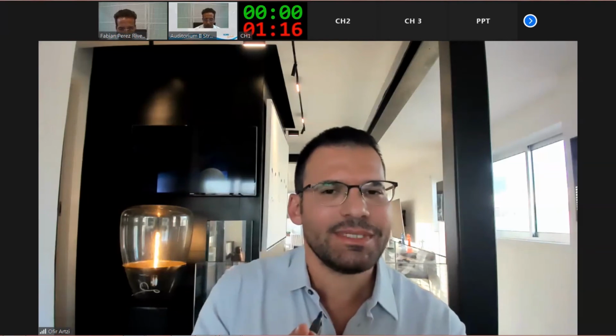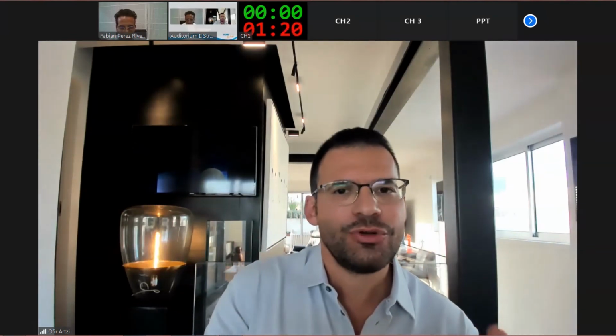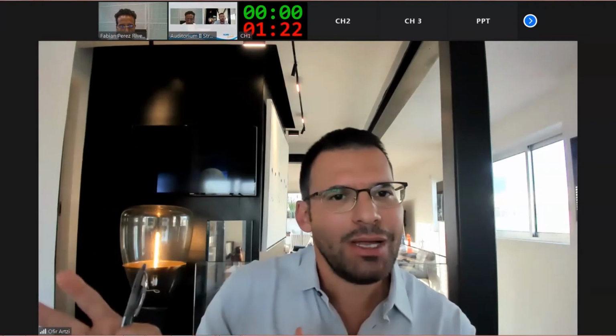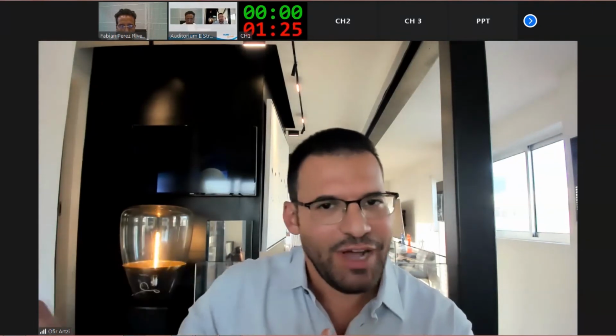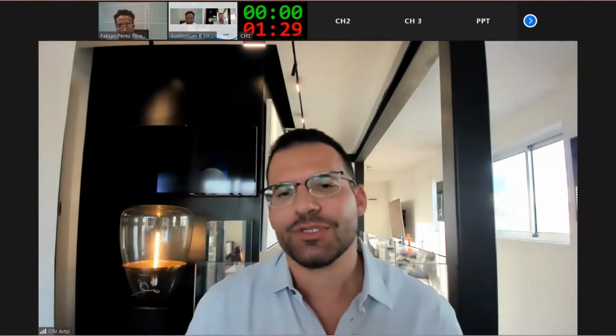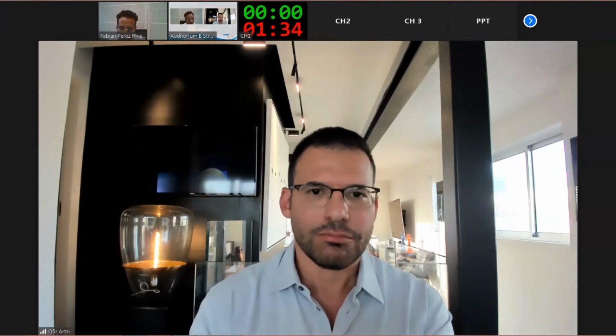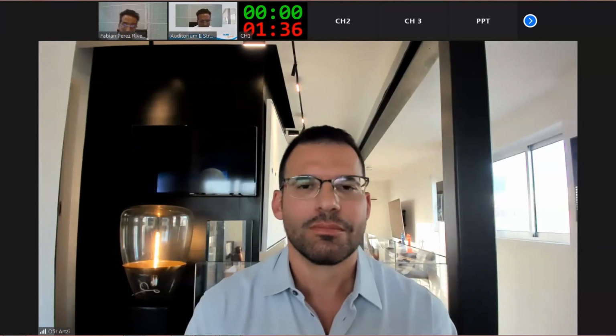So not at the same session. So you perform fractional ablative CO2 laser, and then after 2 months, you perform different devices or different technologies. Yes, yes. I try not to combine in the same session, because in my hands it's going to be really aggressive. I am aggressive with CO2.